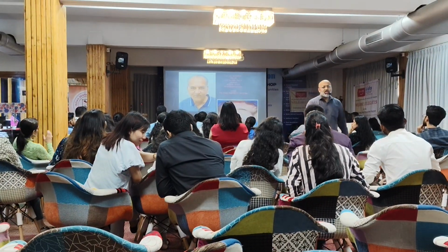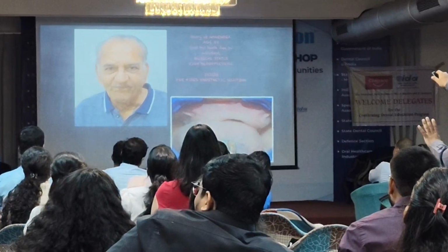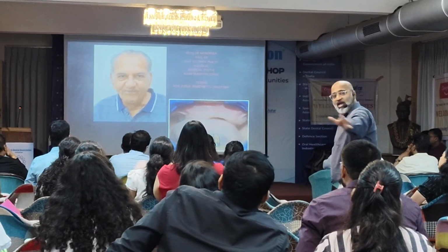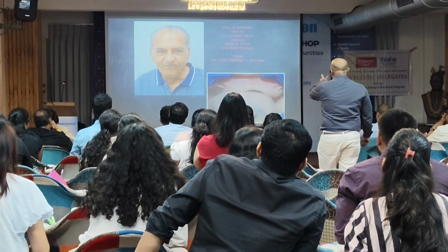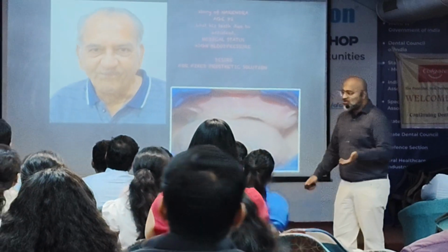So what happened was, can you see something wrong in his face? Something is wrong in his face, right? Yeah, you can say it loudly. The face is asymmetrical. Okay. This was an old prosthesis which had been done back in the 80s. This was called a ring prosthesis.